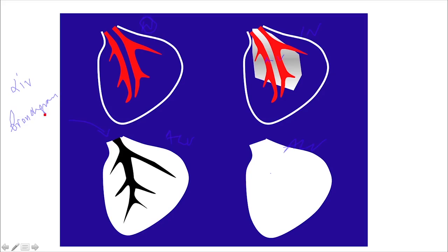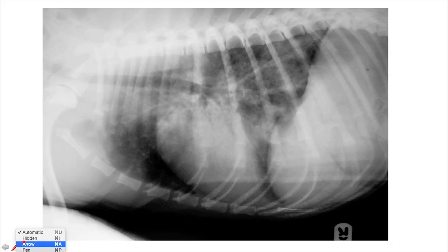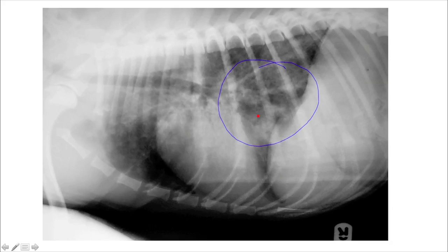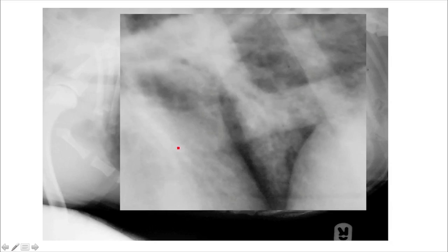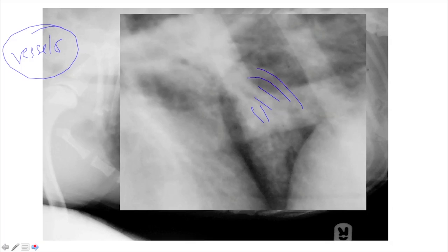In later alveolar disease, the bronchi are flooded as well, so the whole lung is totally radiopaque — totally white — without any visible bronchi. Here we can see clearly an area of increased lung opacity, and even with difficulty in some areas we can see the vessels. Zoomed in, we can actually see the vessels magnified within the opaque lung. So if we can see the vessels in the affected lung, we call it interstitial.